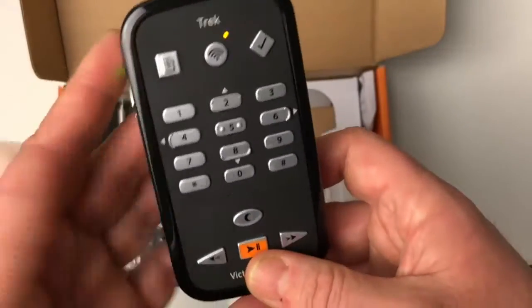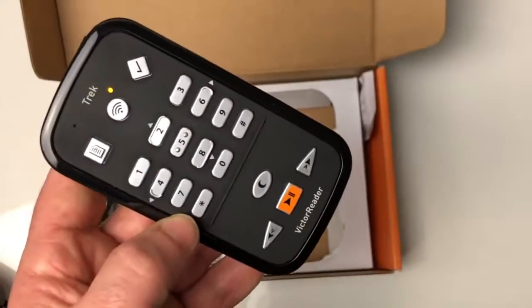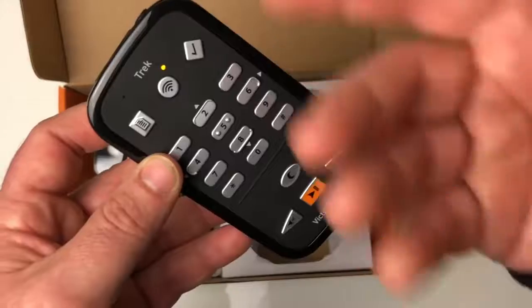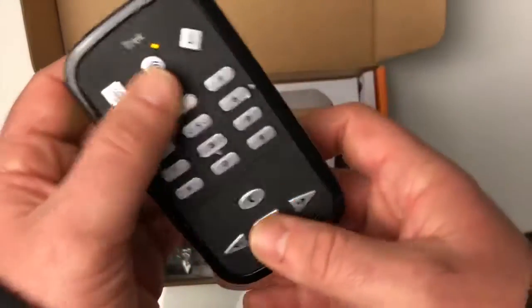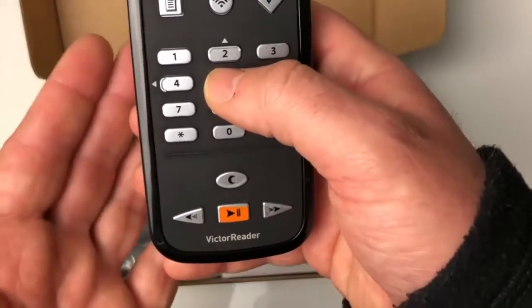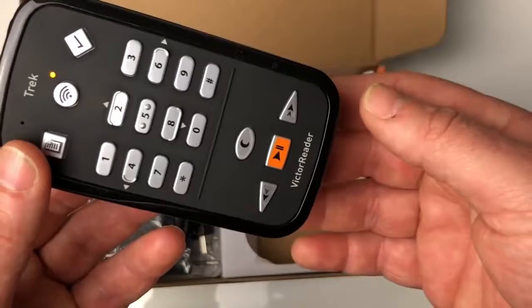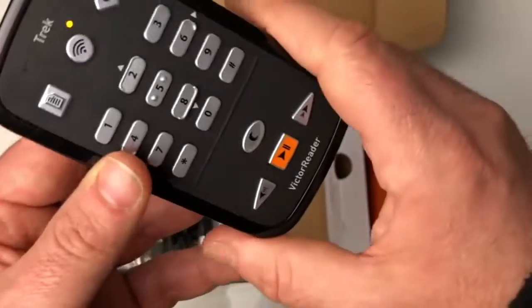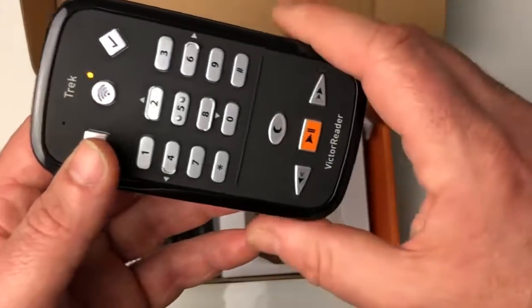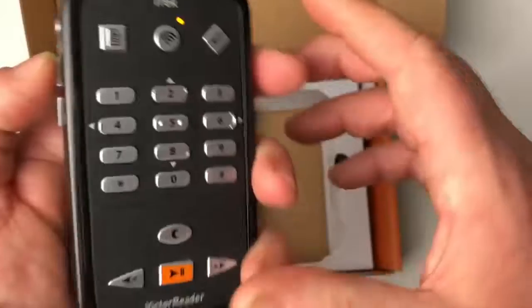Et notre fameux tracker GPS, que l'on verra ensemble — c'est le remplacement du Tracker Breeze. Ils ont mis le logiciel du Tracker Breeze à l'intérieur du Victor Reader Trek. La touche 5, pour ceux qui avaient l'habitude du Tracker Breeze, c'est la grosse touche qui se trouvait en haut. Pas de couverture GPS — on pourra lui demander « Où suis-je ? ». On fera ensemble différentes vidéos sur comment construire une route, comment naviguer, comment se servir du Victor Trek comme petit assistant GPS. C'est vraiment très sympathique. Les boutons sont très accessibles.